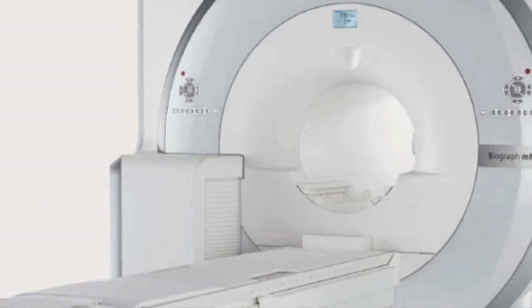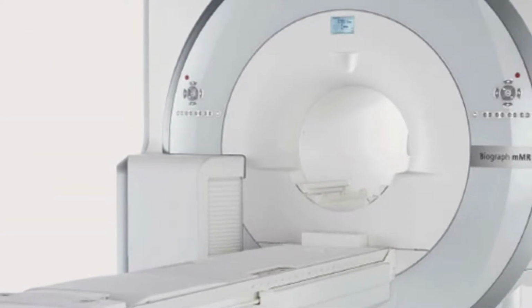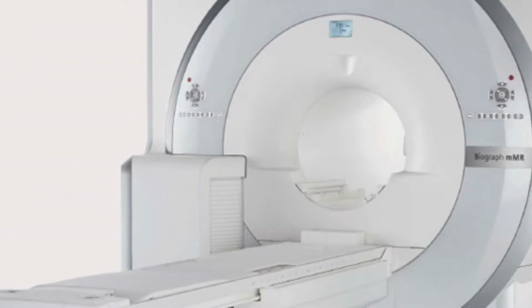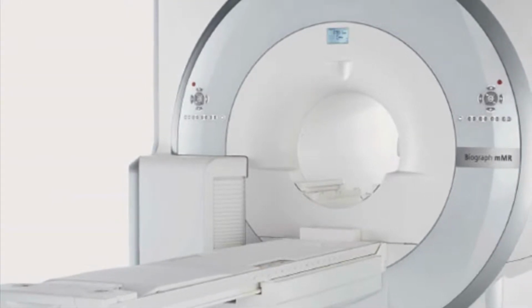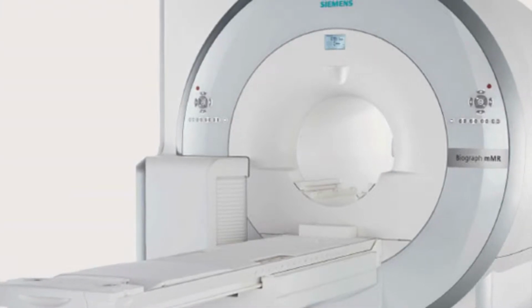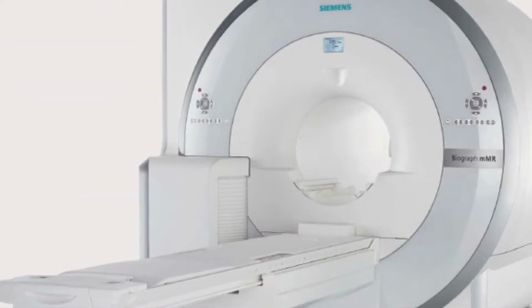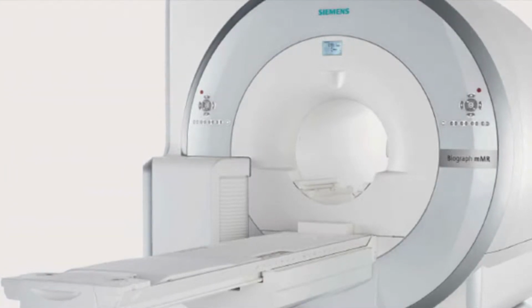Well, a PET scanner is a nuclear imaging test that uses a form of radioactive sugar to create images of body functions and metabolism. A PET scanner can be used to evaluate normal and abnormal biological functioning of cells and organs within a body. PET stands for positron emission tomography.